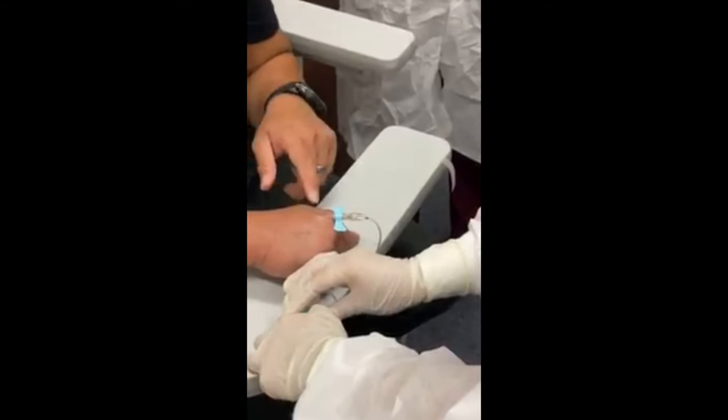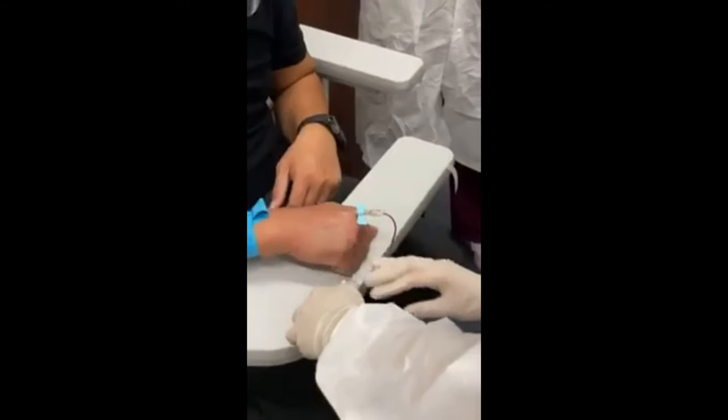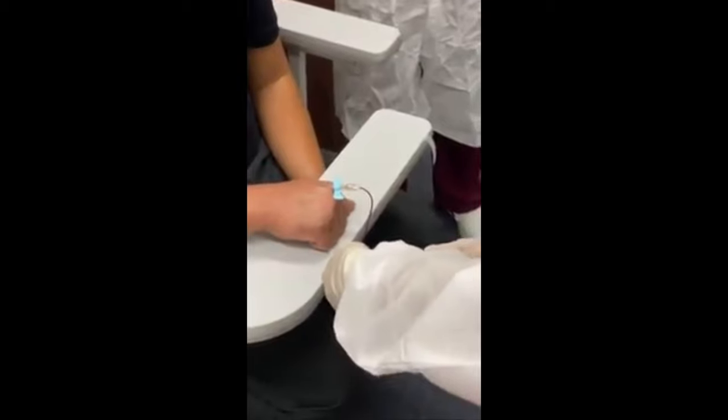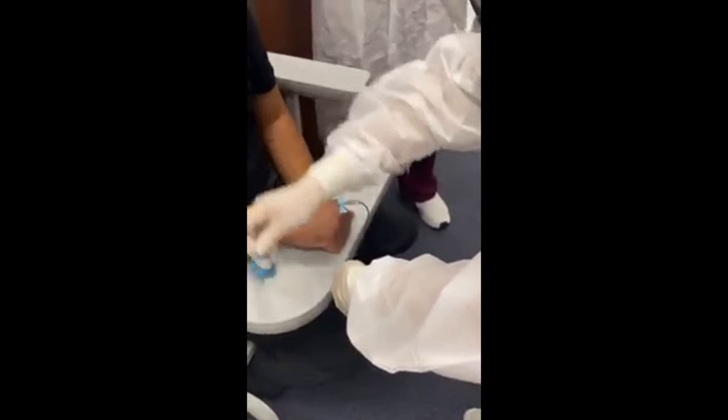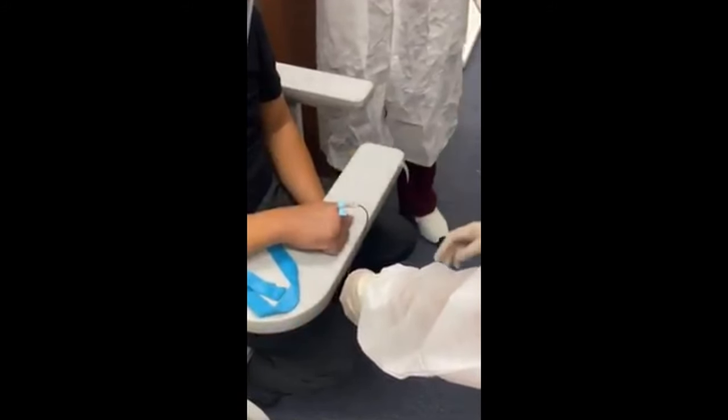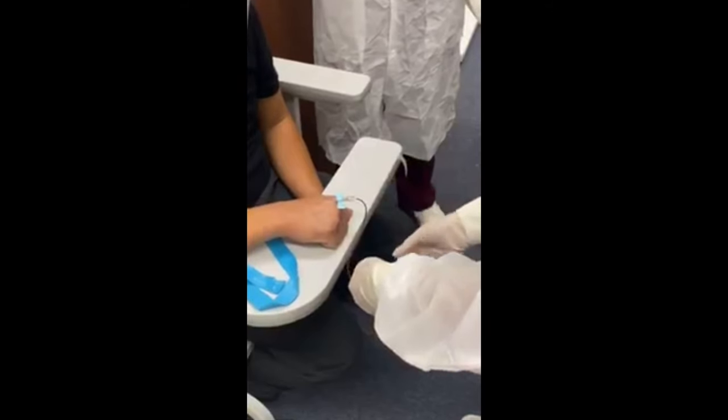Because normally the butterfly in the hand won't go anywhere. It won't fall off or anything. Okay, so perfect. That's the last tube. Let me just untie the tourniquet. Okay, perfect. And then, what can you remove after that?